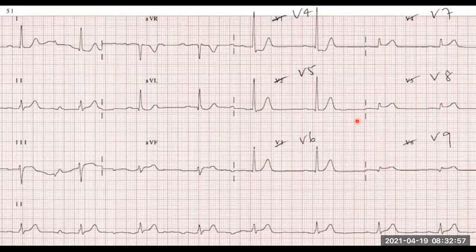Okay, now the most important thing is that when you do this type of ECG, whether you're checking for right-sided or posterior, is to label it. Otherwise, nobody has an idea of what you are seeing. Because then you've got two conflicting ECGs sitting in your file. You've got one that's showing a whole lot of ST depressions, and then you've got one that's showing ST elevation. Now, which one is which? When were they done? So that's why you need to mark them. Scratch out 15 lead, 18 lead, and put which leads you actually used. So the person can actually see what's going on.